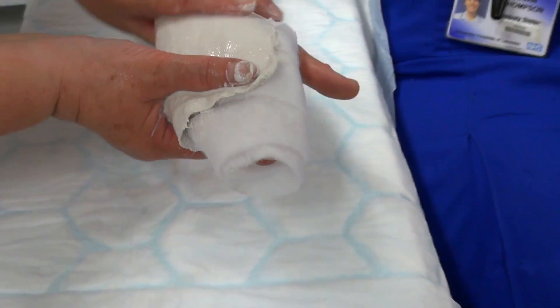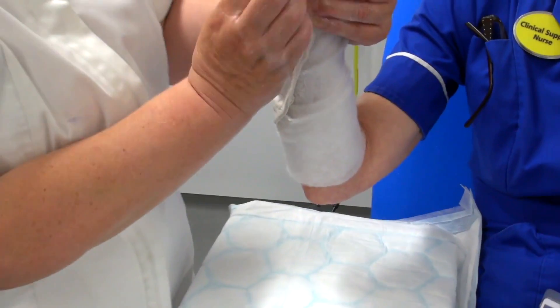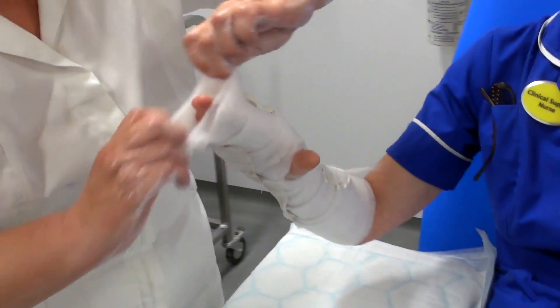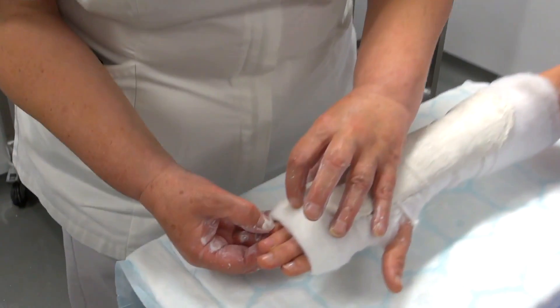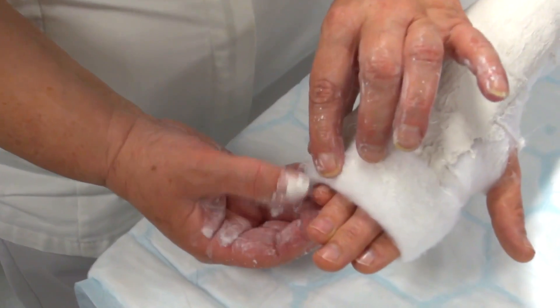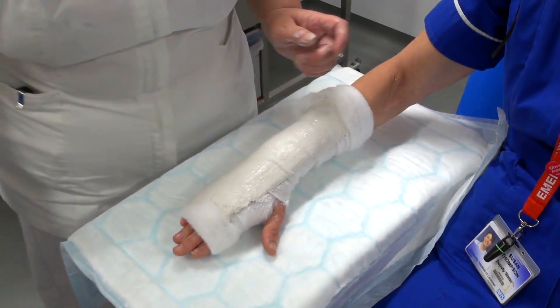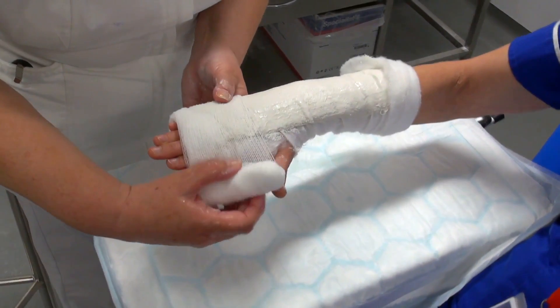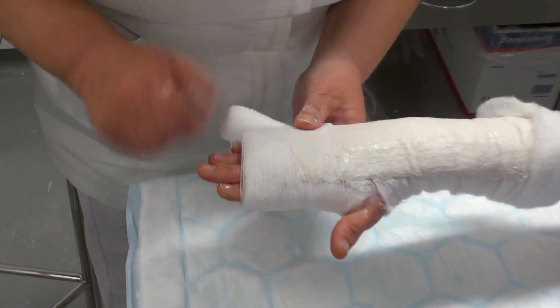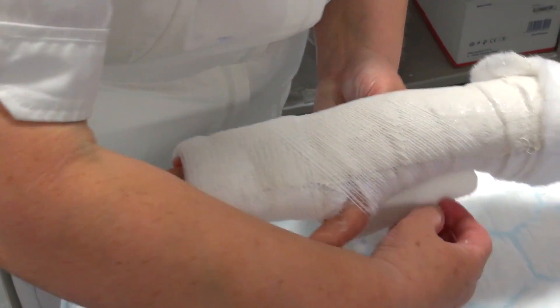So you bring it — if you just lift your arm up, Sue. It's just underneath there, so it's half and half — half there, half there. When that's on, turn it back so you can see the finger, see the little finger. Starting again by your finger — bandage. It wants to be quite a snug bandage, so it keeps everything on.